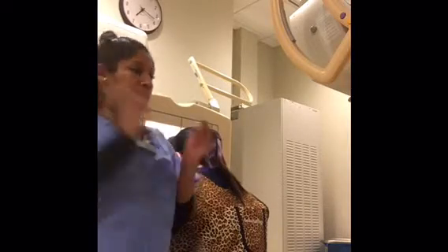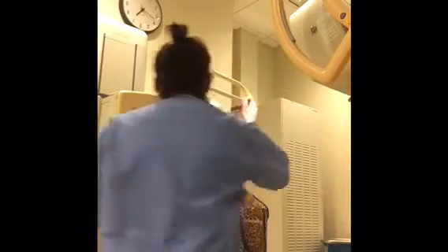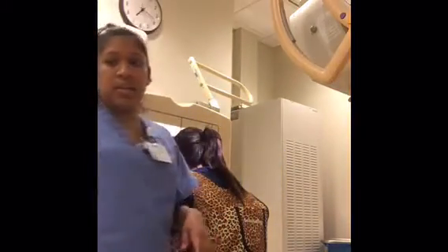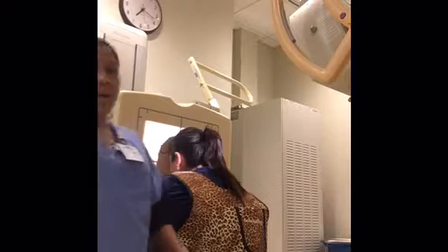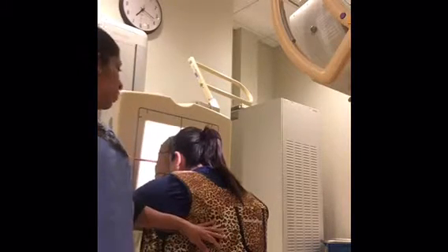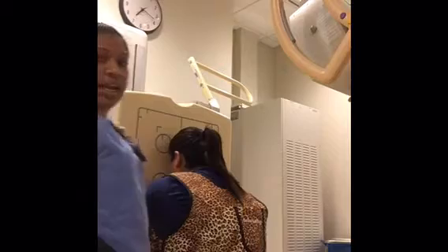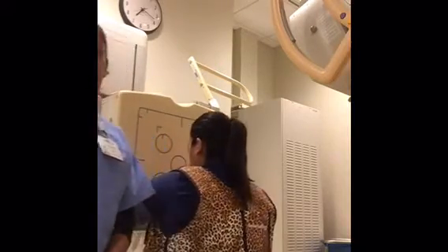And I'm going to put my right marker here on the right side. We shielded our patient, and now we are ready to shoot our x-ray. Okay, please take a big breath and don't move. Beep, x-ray. Okay, you can breathe and relax. And now we are ready to shoot our next image.